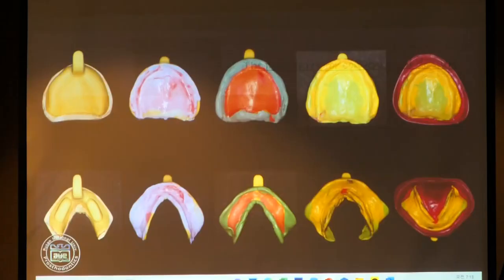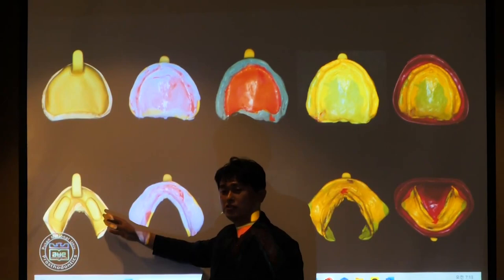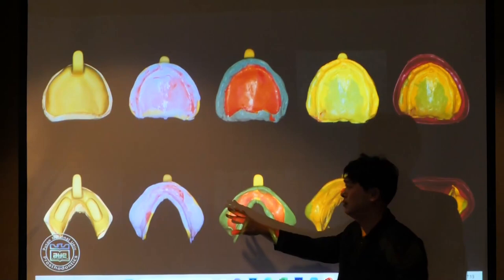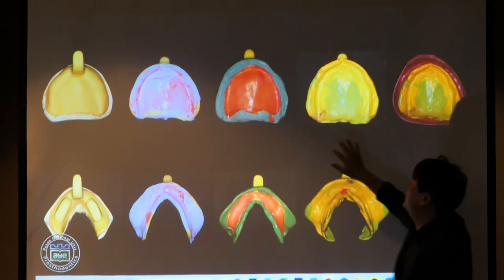So after making the individual tray based on the preliminary alginate impression, you check the inner surface. If the tray has overextended borders, definitely the impression was not correct. Anyway, you have to check the border length and the inner surface, then do border molding with the molding compound or silicone material, and then take the impression like this, and then beading and boxing will proceed.